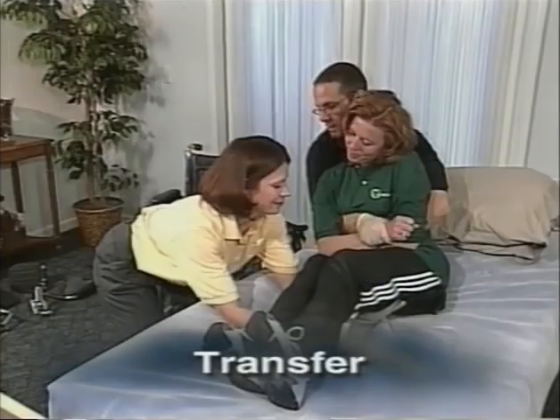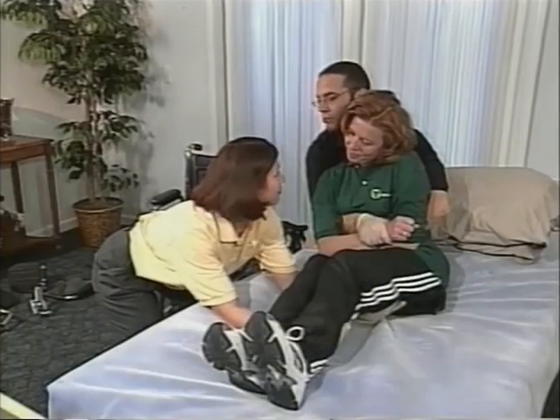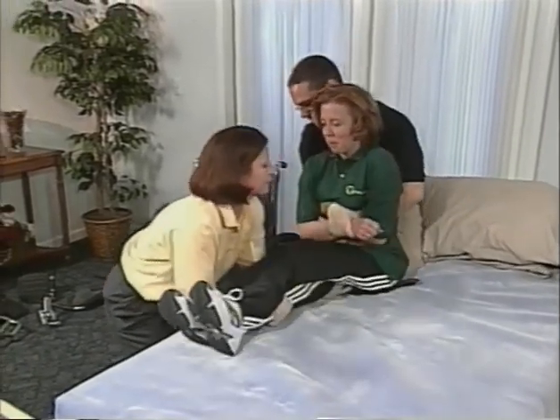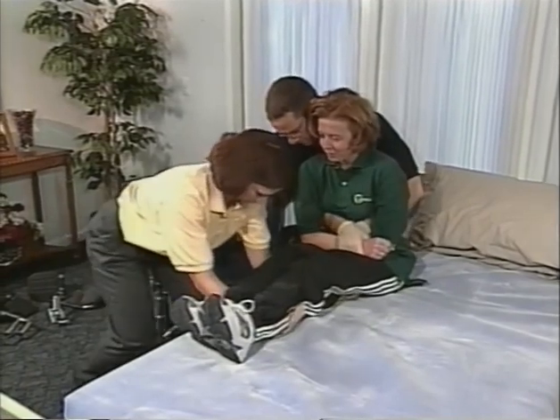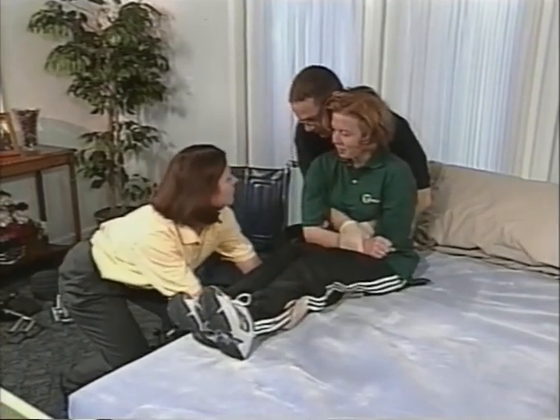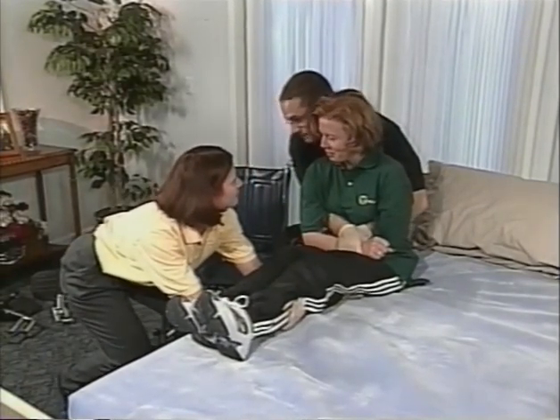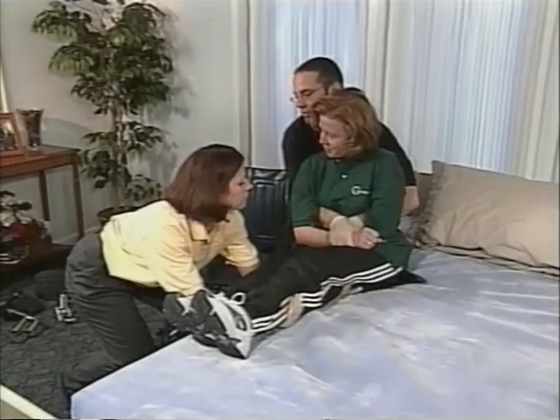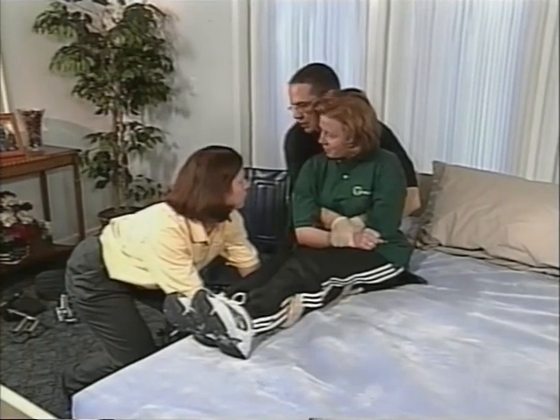To perform the transfer, the top person counts to 3. On 3, both positions transfer their weight from one leg to the other and position the client on the edge of the bed. Use the strength in your legs to perform this lift, not your arms and back. The top person repositions his feet with one foot in between the bed and the wheelchair and one foot behind the wheelchair. Repeat the count and lift into the wheelchair.